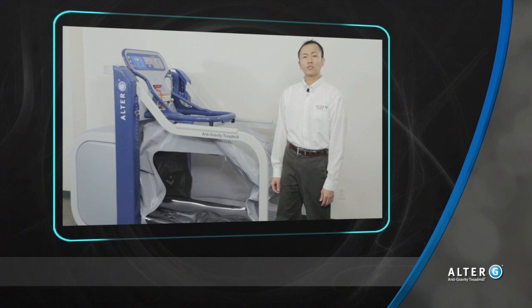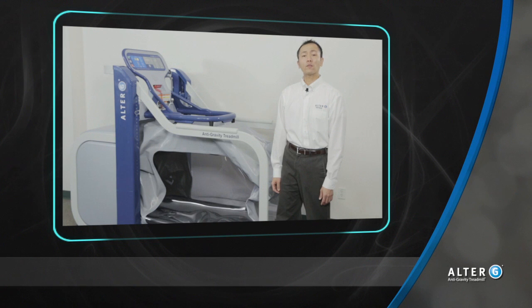I hope this short video has shown you how you can use the Alter-G to help gait train your patients. Whether it's orthopedic or neurologic, sports or geriatric, they can all benefit from the differential air pressure technology. For more information, you can look us up at www.alter-g.com. Until next time, defy gravity and defy your expectations.